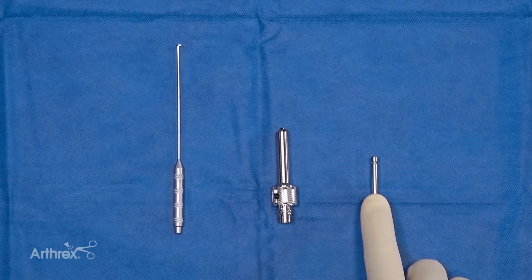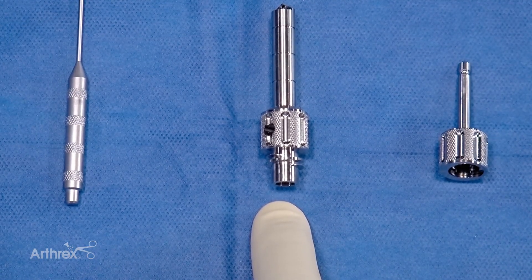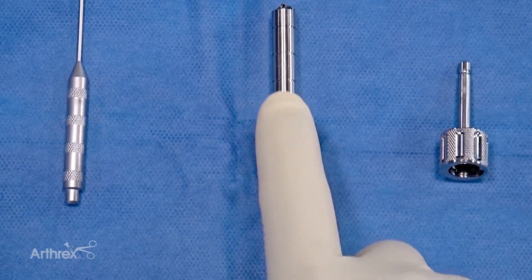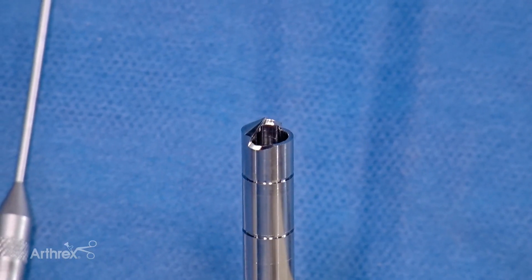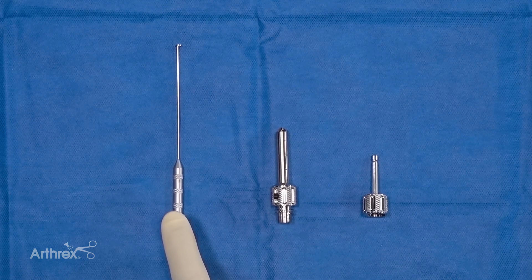Here are the components of the system. This is the drive system with the AO Quick Connect. This is the harvester with the tip for morselizing the bone graft, and here we have the plunger for extraction of the bone graft after it has been collected.